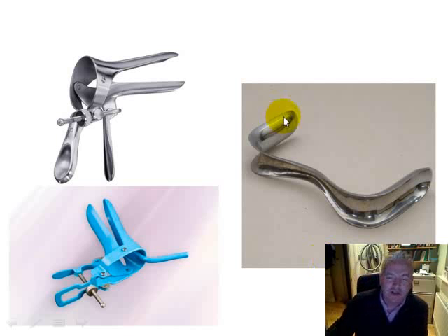Often used in association with the curettes and the dilators are the SIMS speculum. There are various types of vaginal speculae. The two main ones that you would be shown are SIMPSONS or Graves and CUSCOs. CUSCOs speculum is just a single hinge. Graves also will have a mechanism of enlarging the aperture of the external element of the speculum.